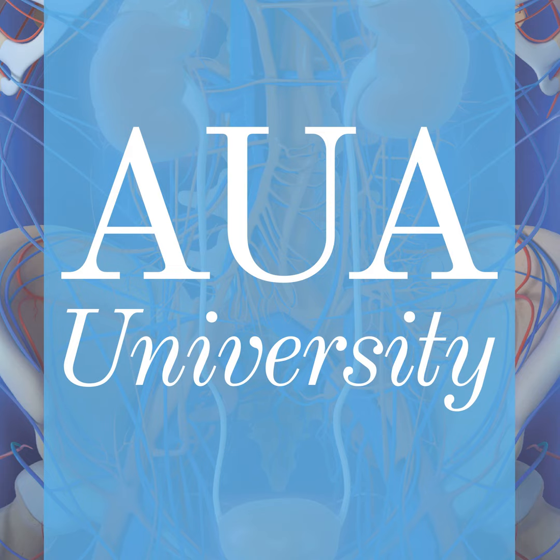So you can use a PSMA PET scan to stage your patients at least locally and systemically in order to have an idea if this might be a candidate for some type of local curative second-line treatment like radical salvage prostatectomy. However, as in the situation of treatment-naive, locally advanced prostate cancer, you always have to do an extended pelvic lymphadenectomy to identify those patients who might have positive lymph nodes.